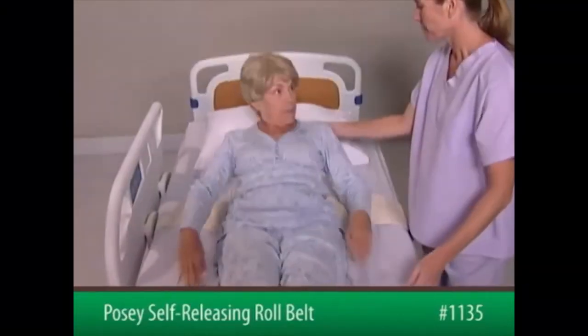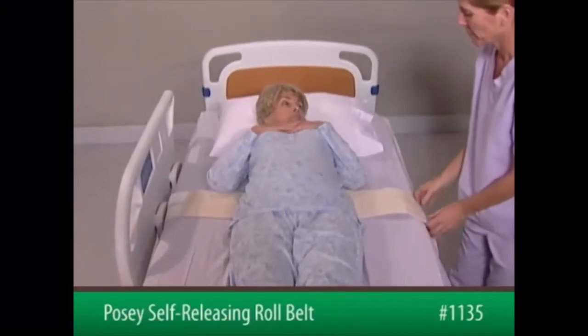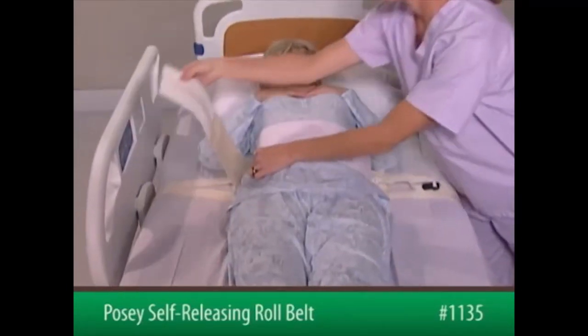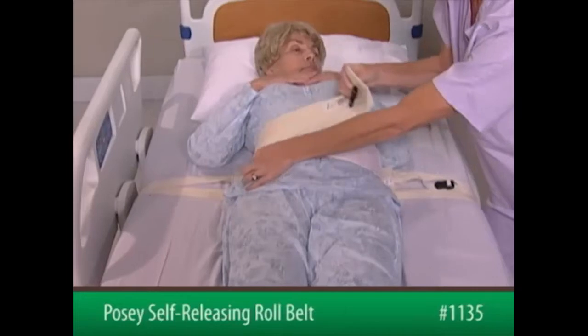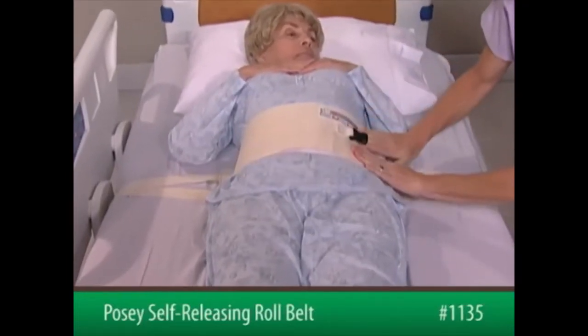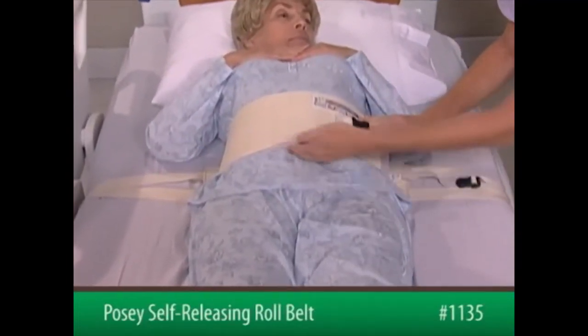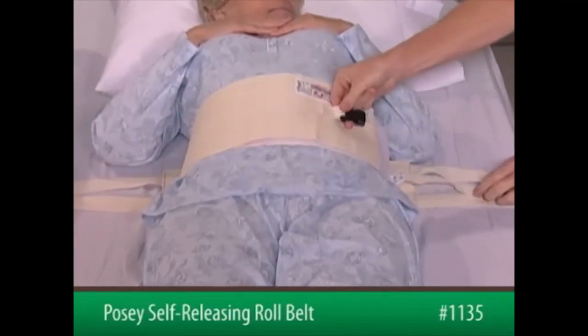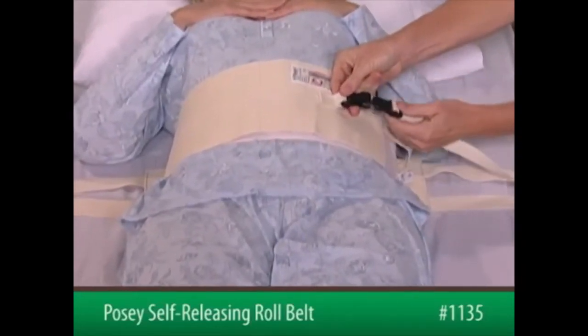Now, position the patient in the bed with the belt at waist level. Bring the belt around the patient's waist and secure it with the hook and loop fastener. Slide an open hand flat between the device and the patient to ensure proper fit. The belt must be snug but not interfere with breathing.